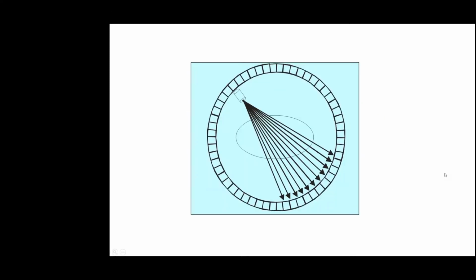And if we do it for a number of adjacent slices, we would end up with a good 3-dimensional reconstruction of what is the attenuation of different things. And here we can see, well, this is across the abdomen, and we can see mostly the spine. Yeah, in reality, it's not as easy as solving this system of equations, but it's not terribly complicated either.